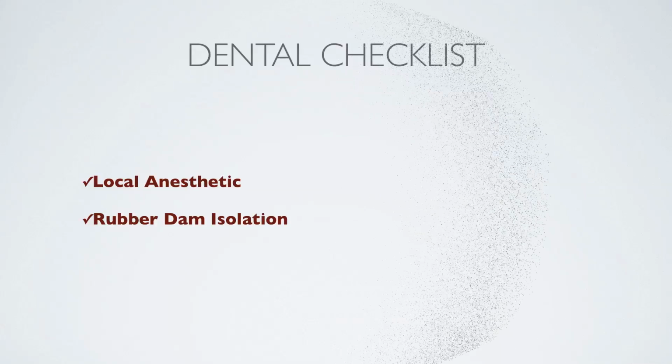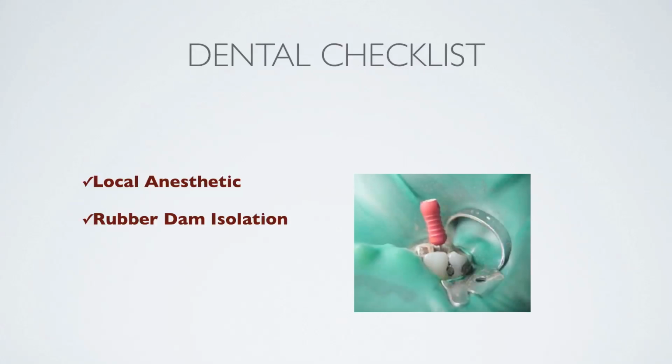Before initiating treatment, I always start with single tooth isolation of the tooth undergoing root canal therapy. This will decrease contamination while making us more efficient and the case more successful. You can see we use a stepwise protocol before actually initiating treatment, which allows for a smooth transition into accessing the tooth.